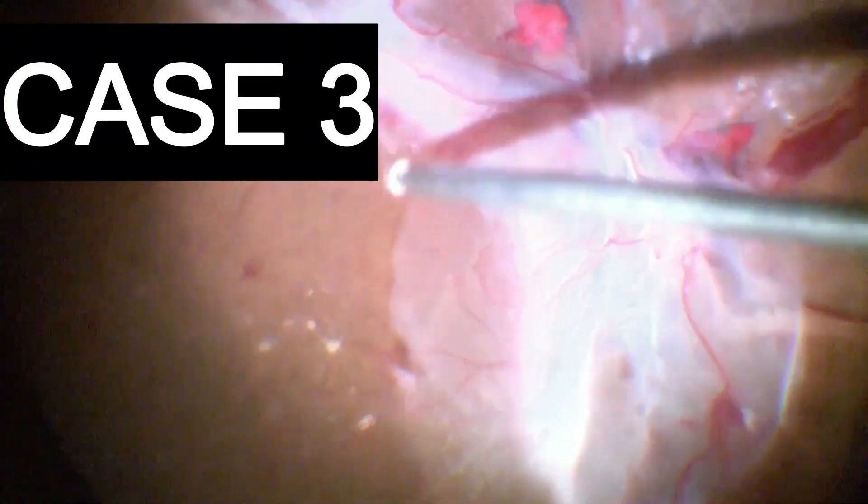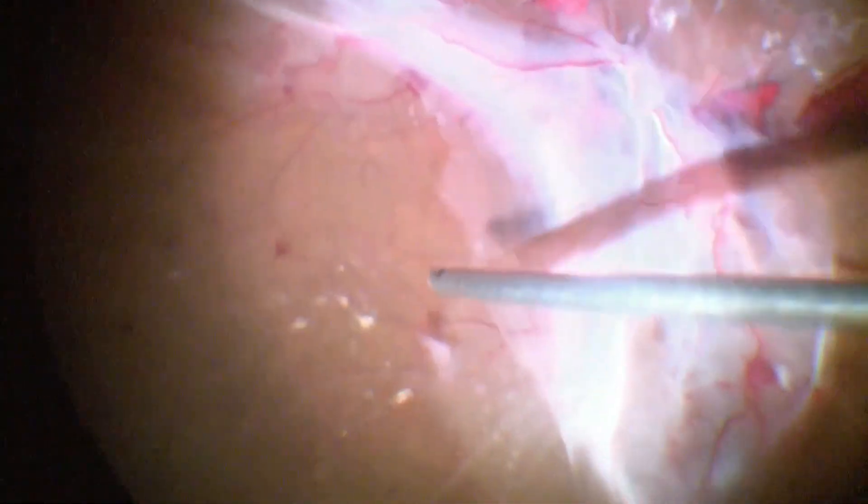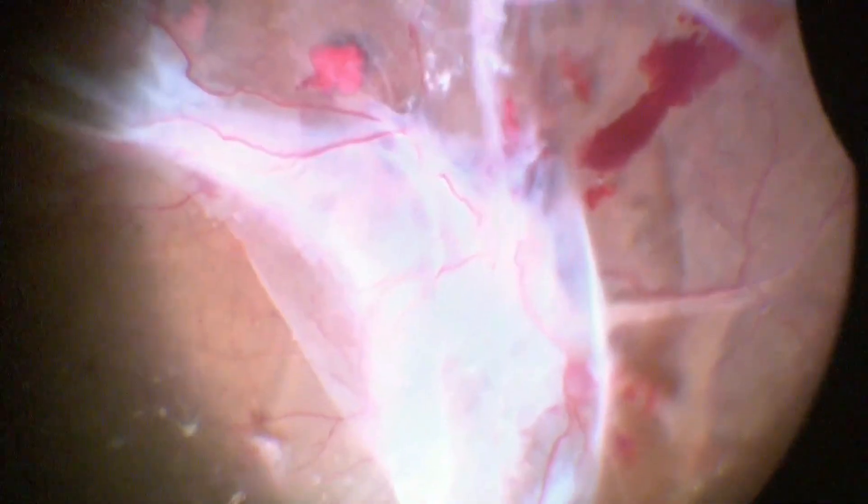Thick neovascular proliferations are tackled once again with a cutter. Bridging traction is released by insinuating the cutter between the spanning sheets and the underlying retina.